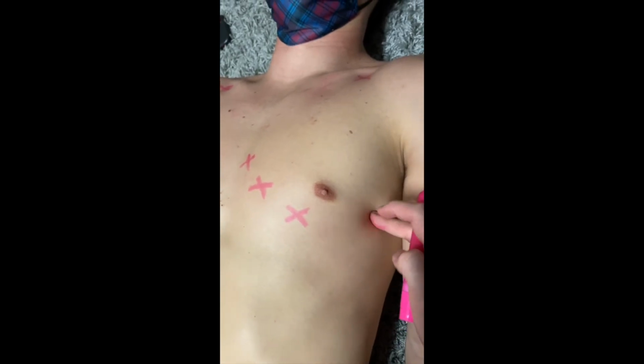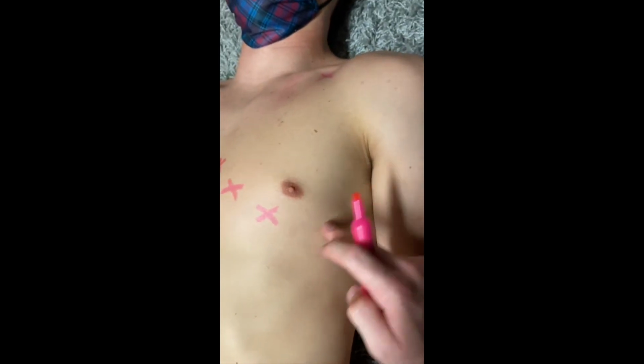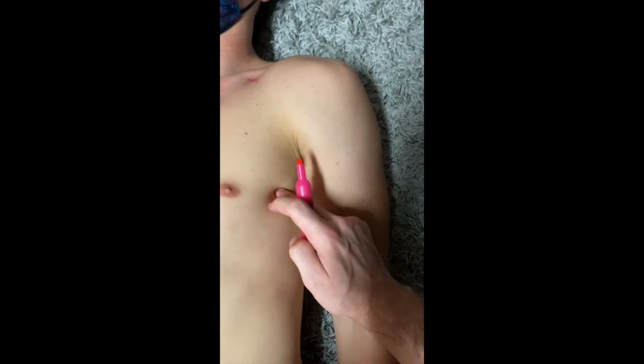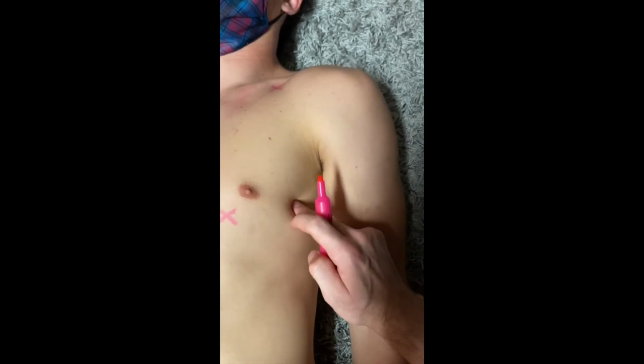So we can feel this rib's intercostal space right here under the armpit, and you can see that it's a little bit higher just to accommodate that space. So I just lost it. Sorry, I gotta find it again. It's right there.